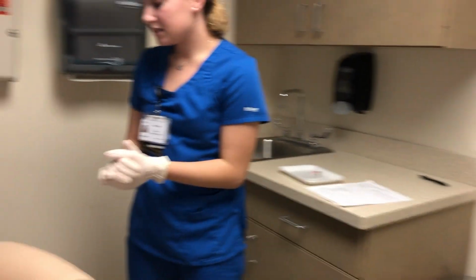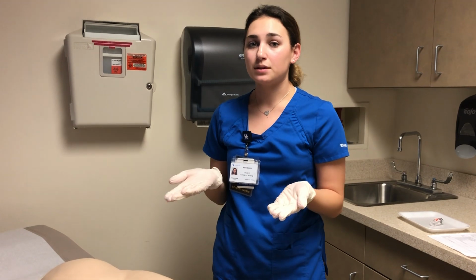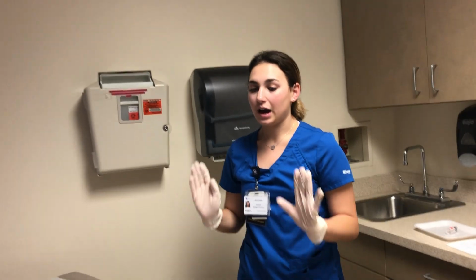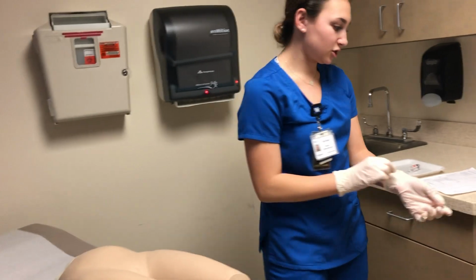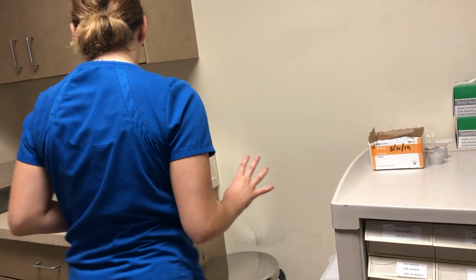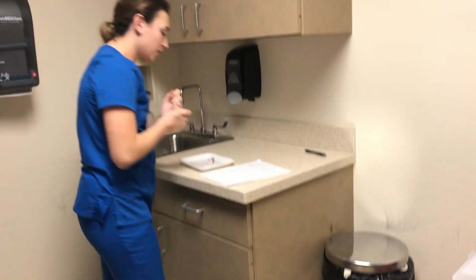And I forgot to say that before I gave the injection, I would raise the bed and lower the side rail closest to me, and then when I'm done giving the injection, I would raise both side rails and lower the bed to its lowest position. I'm going to discard my gloves, not touch the trash can, and then I'm going to wash my hands.